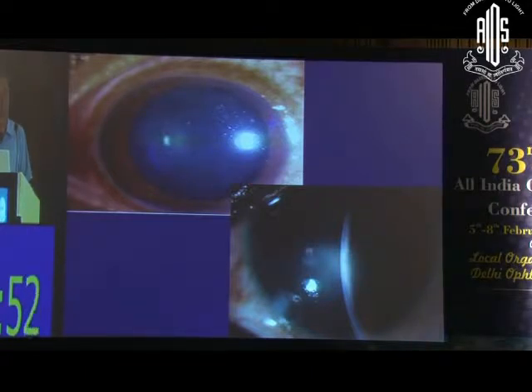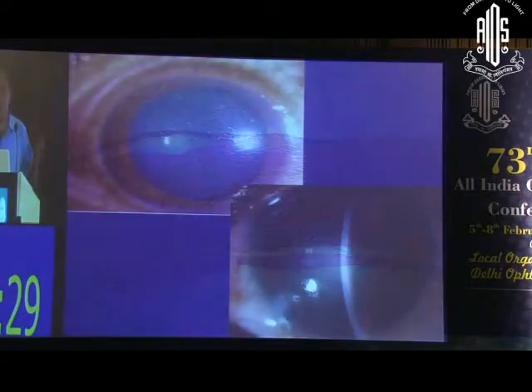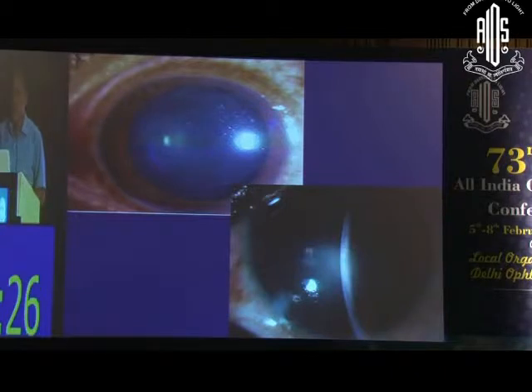Okay, I tell you that he came with history of burning in his eyes. Okay. So do you see infiltrates over here? There are. What kind of infiltrates? Full thickness, anterior, posterior? Okay. Now this was a corneal. Okay. What would be your differential diagnosis? Acanthamoeba. Okay, that's a good differential. Anything else that you would want to think of? Microsporidia, that's another good differential.